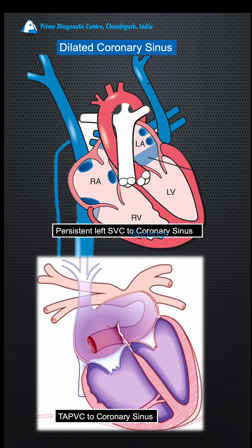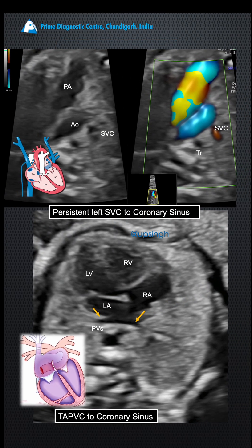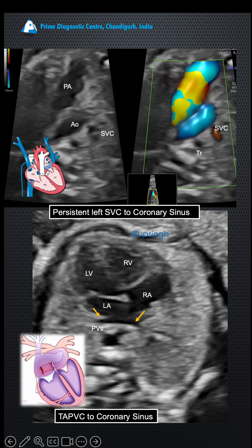In this patient, if you notice carefully, there is a superior vena cava on the right side but no left SVC. And the pulmonary veins were draining into the left atrium. So neither of the two common differentials could explain the dilatation of the coronary sinus.